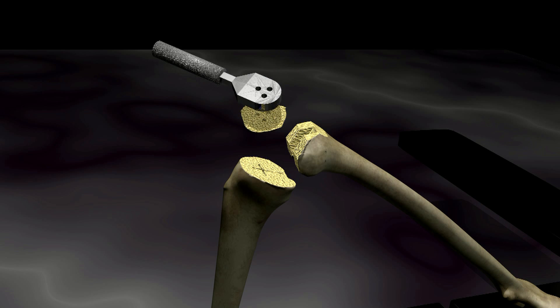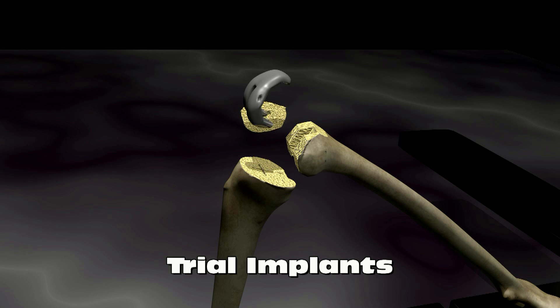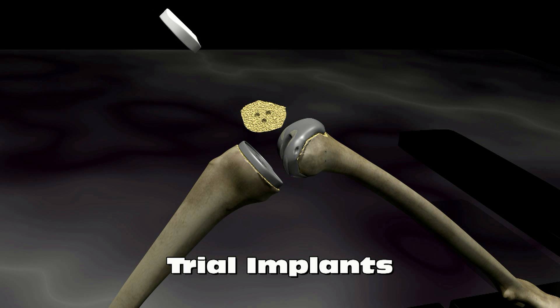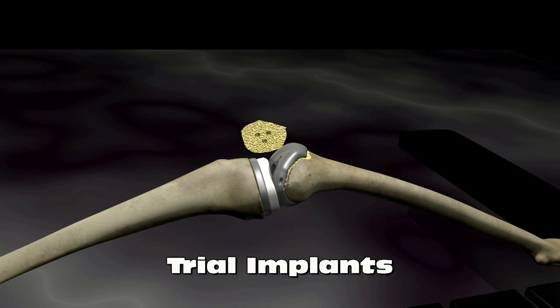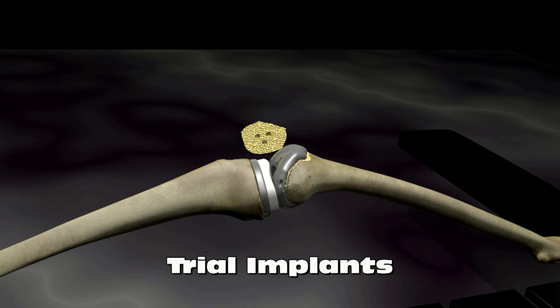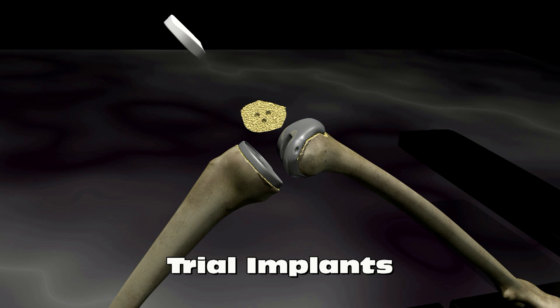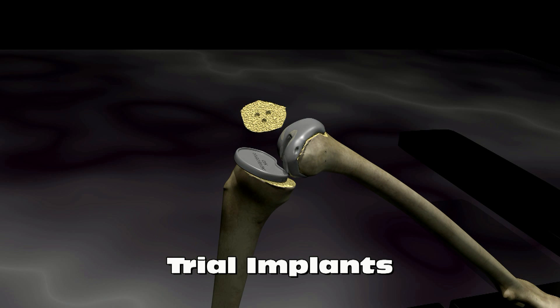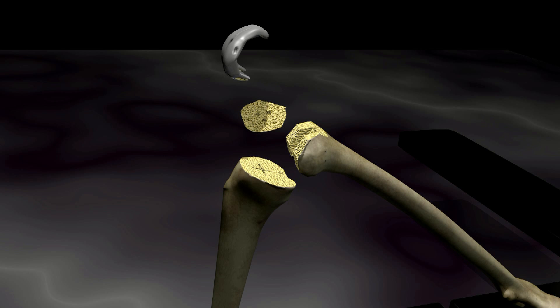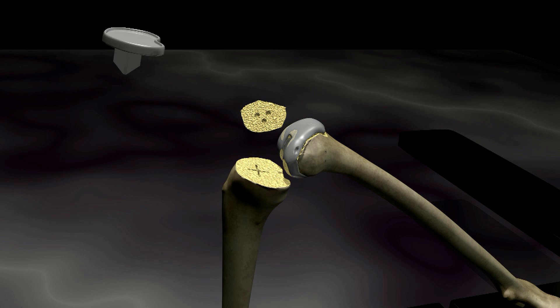Once the femur, tibia, and patella have all been prepared, trial implants are placed to make sure that the knee is well aligned and has good range of motion. The trial implants are removed. The real implants are then cemented in place.